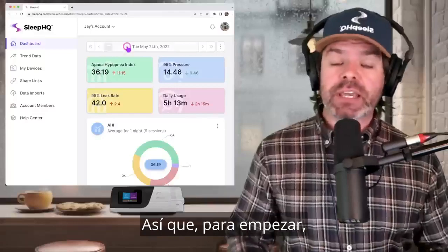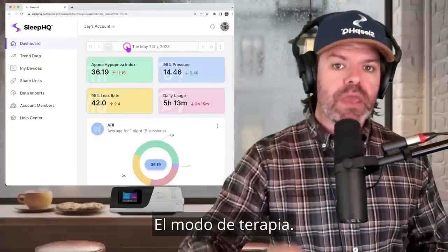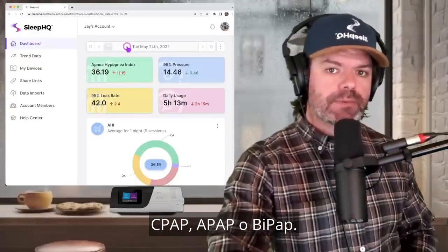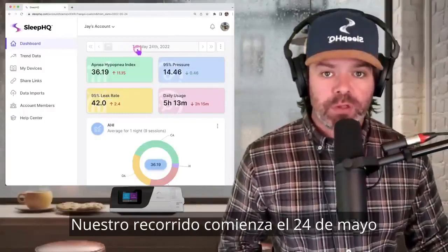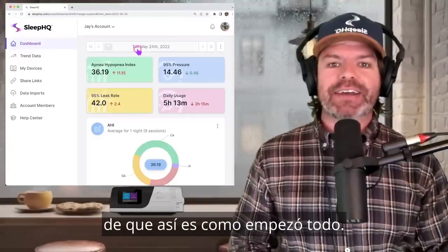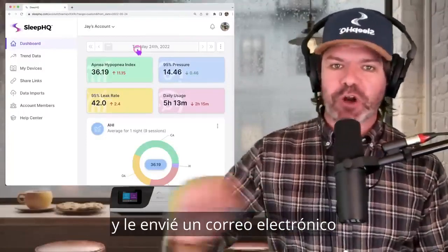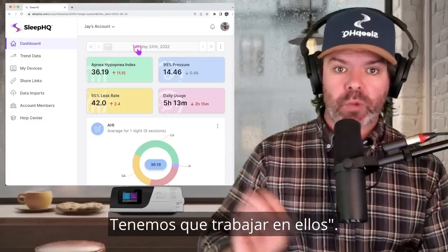All right, so to begin, let's take a look at element number 1. Therapy mode: CPAP, APAP or BiPAP. Our journey begins on May 24th and his results are terrible. In fact, I'm pretty sure this is how it all began. Jay connected with me on Sleep HQ. I checked out his results and shot him an email and just said, mate, these results are terrible. We need to work on them.